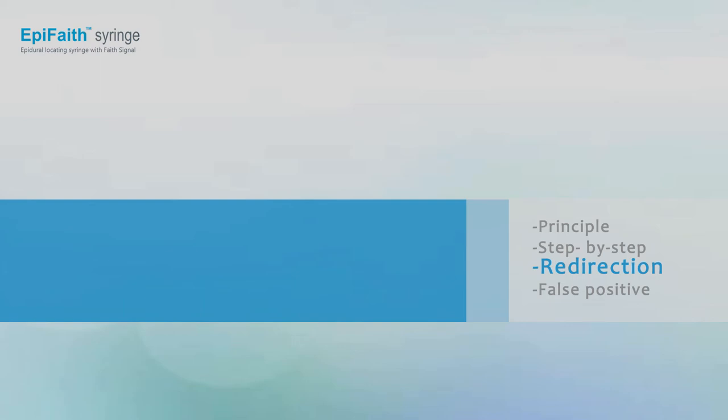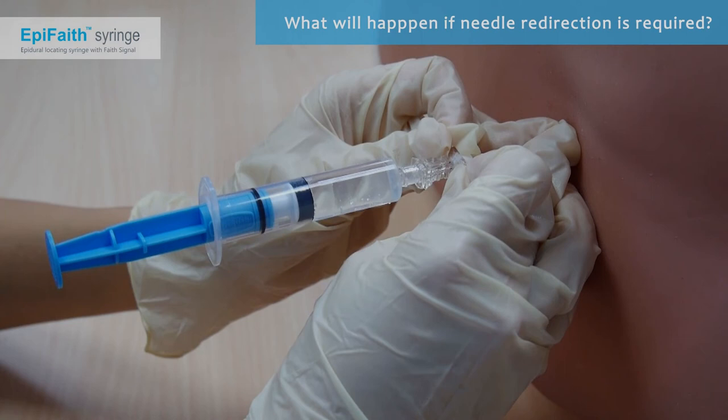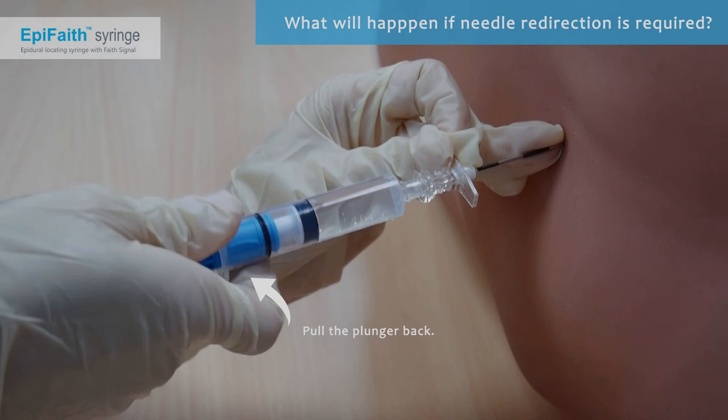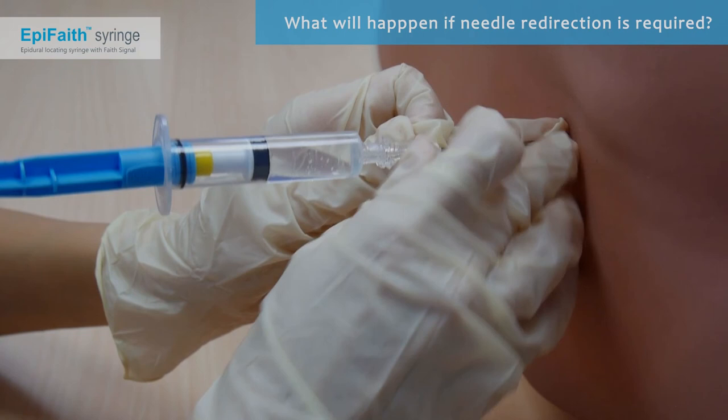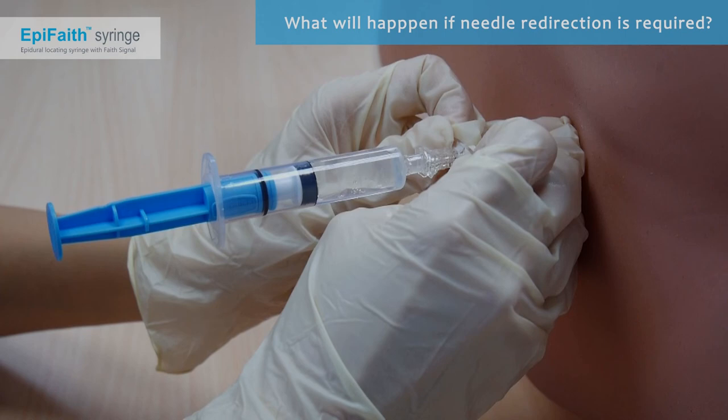What if needle redirection is required? Sometimes advancement may be obstructed by bones and additional attempts may be required. Simply pull back the plunger to reduce pressure before redirecting or withdrawing the needle. Push the plunger again to restart pressure sensing. Epiphaeth is easy to use even if redirection is required.